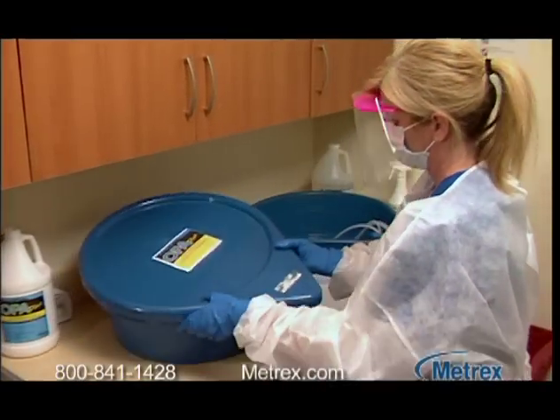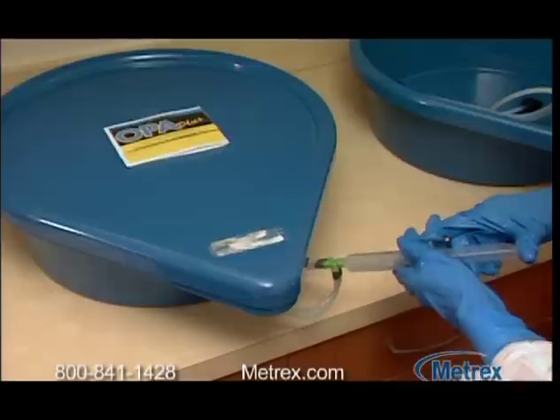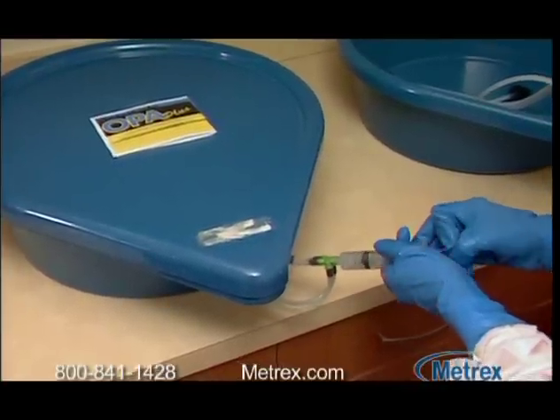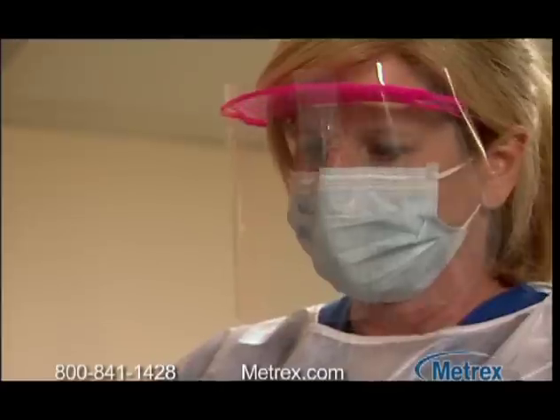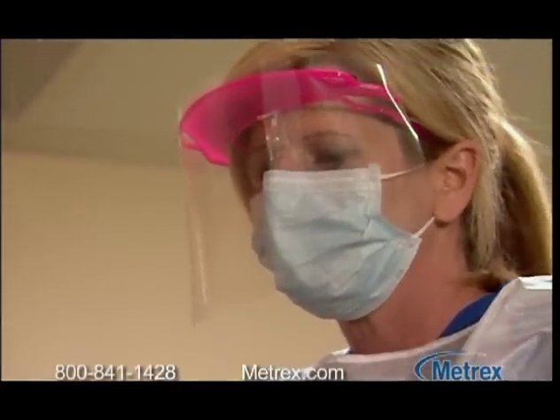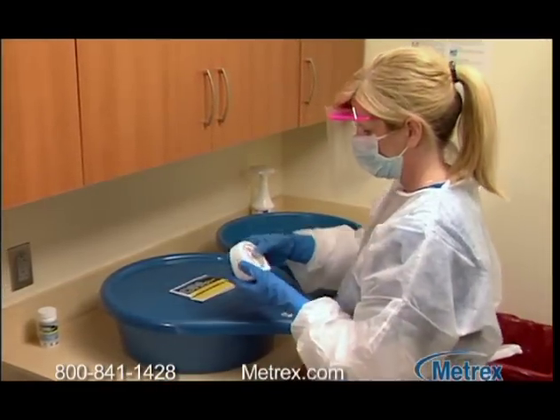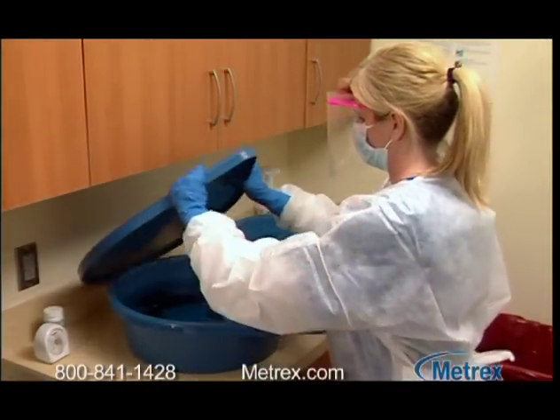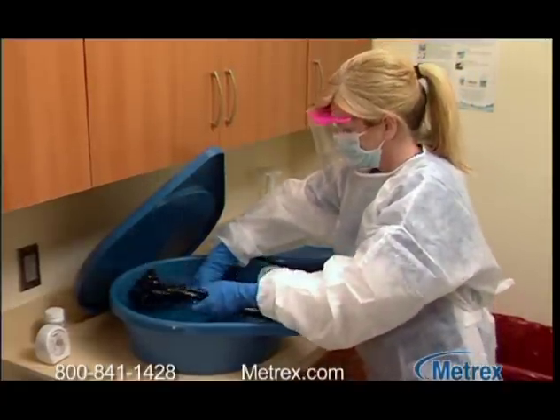When handling disinfectants and contaminated equipment, always wear the appropriate personal protective equipment to protect yourself from exposure to chemicals and blood-borne pathogens. This includes nitrile gloves, fluid-repelling gown, mask, and eye protection. Metricide OPA Plus Solution can temporarily discolor skin or stain clothing. If your skin comes in contact with the solution, wash thoroughly with soap and water.